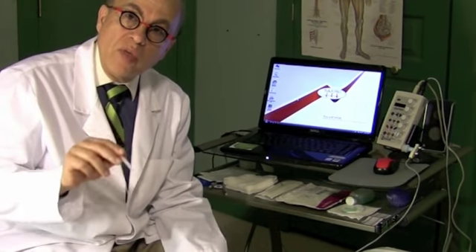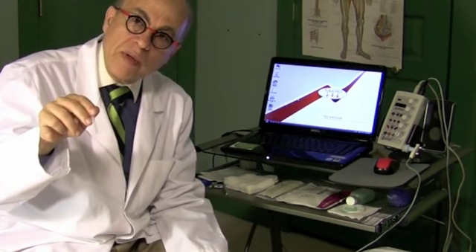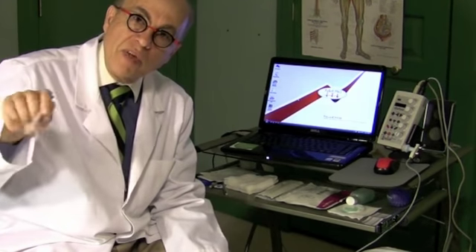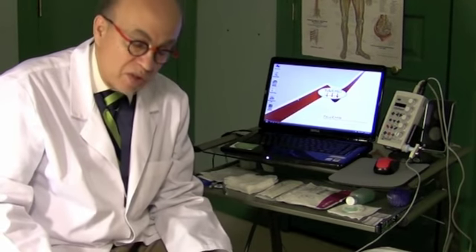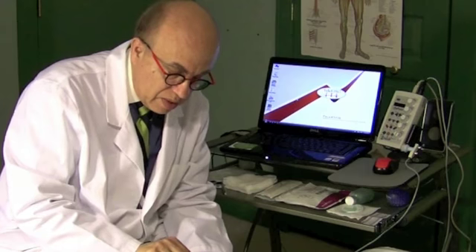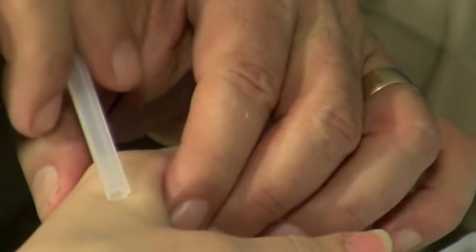So the first thing that we do when you stick the needle in the muscle, we want to look for these muscle fibers that lost their nerve supply. So we insert the needle in different places to find out if the muscle is showing signs of denervation, loss of nerve supply, and emitting electrical activity that are fibrillation and positive waves. So the first thing that we study with the muscle is the muscle at rest with insertional activity. That means the muscle is not moving, we're just inserting the needle.